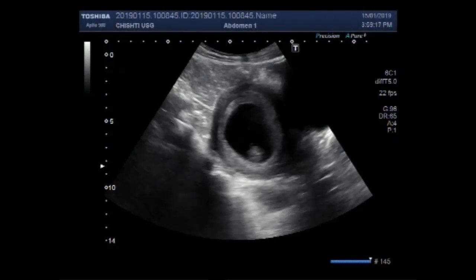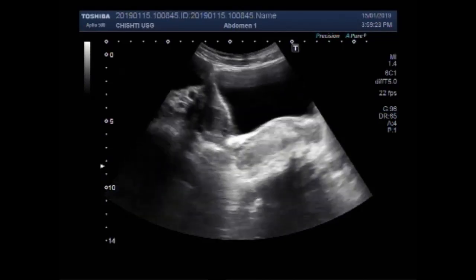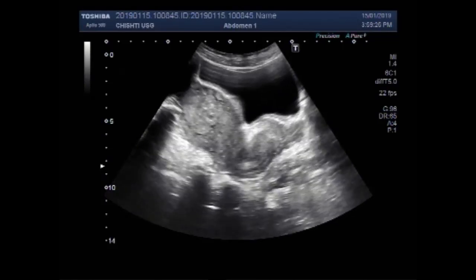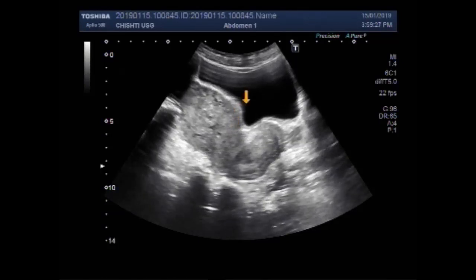Dear viewers, I hope you are all fine. This ultrasound video shows an early pregnancy with an ovarian cyst.